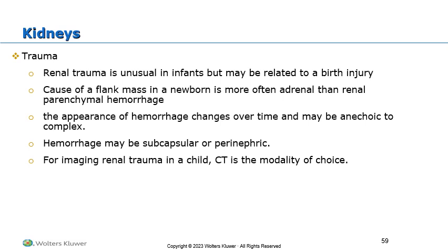So anytime we're looking at trauma, we're going to be concerned about a hematoma. So that hemorrhage is going to create a hematoma. The hematoma is going to act like a clot. So we're going to see that transition from hypoechoic to anechoic to low-level echoes to moderate-level echoes to complex to ultimately resolving and becoming anechoic, and then being resorbed or becoming calcified as a chronic clot.